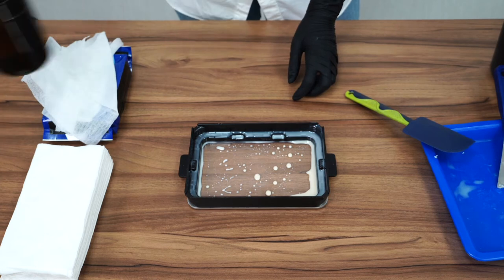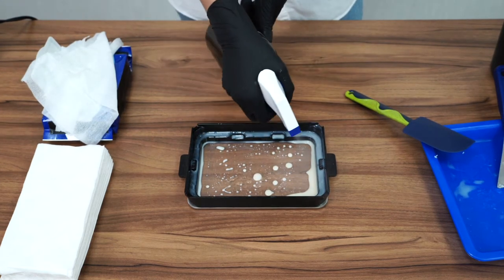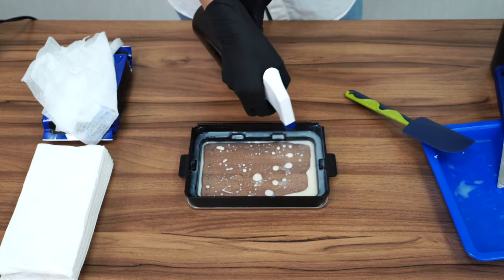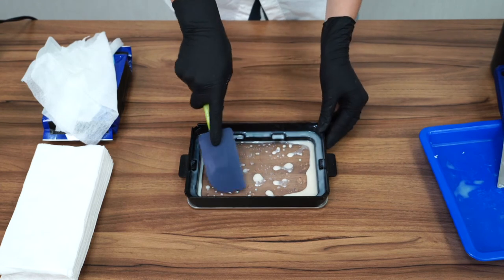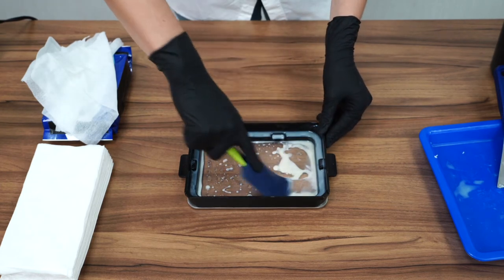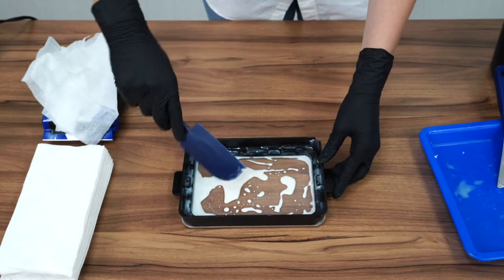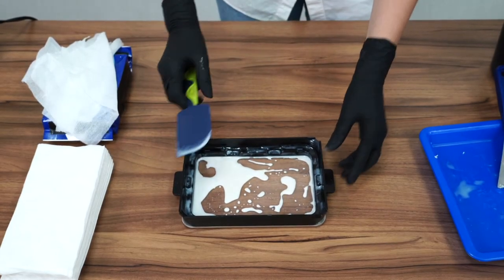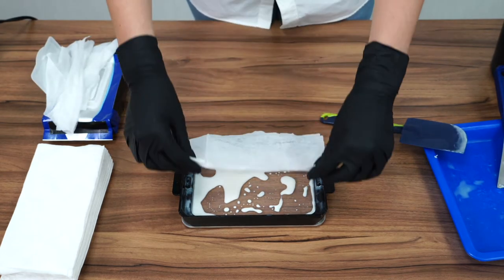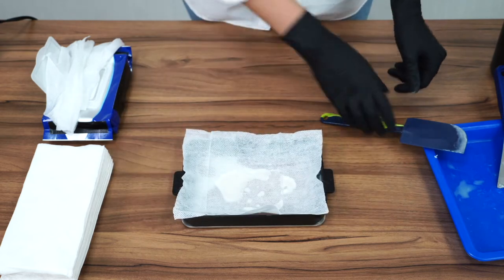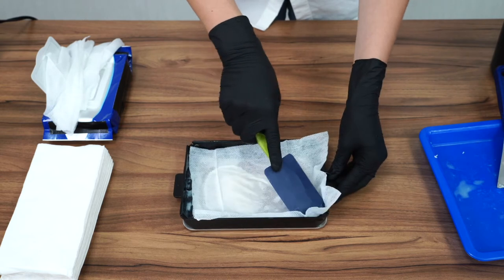So our first step is going to be taking alcohol and spraying it generously inside the vat. Then I take a rubber spatula and mix the whole thing together. In my next step, I'm going to take an alcohol wipe, place this on top of the vat, and push it into the corners of my vat here.